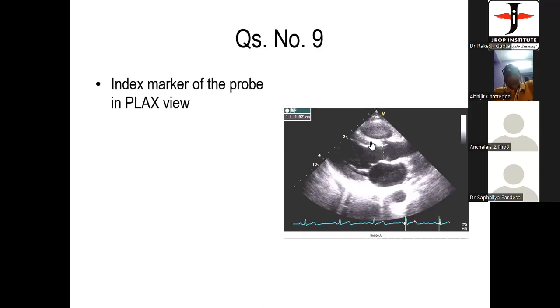Can you repeat what I told you? So LVOT and aortic annulus are measured in systole, and sinus of Valsalva is measured in diastole. How do you know that it is systole? So the aortic valve leaflet will be fully open, and it will be parallel to the aortic wall.